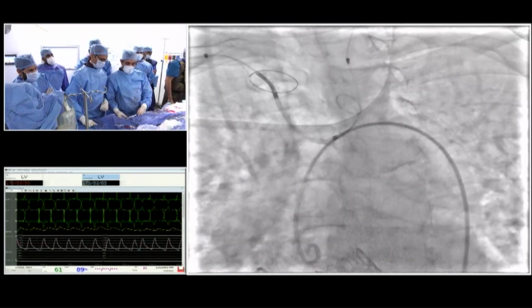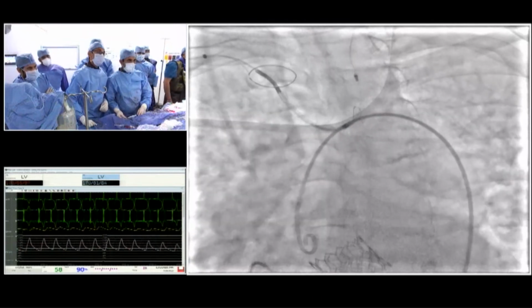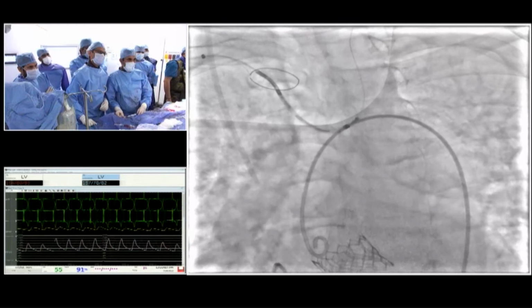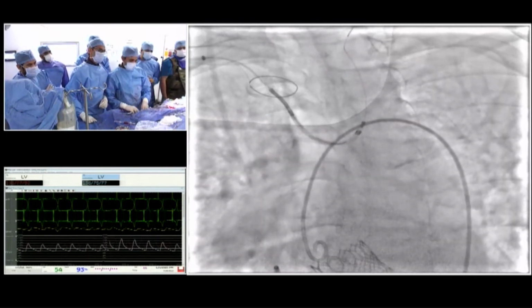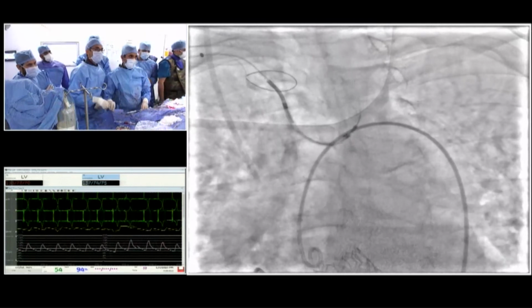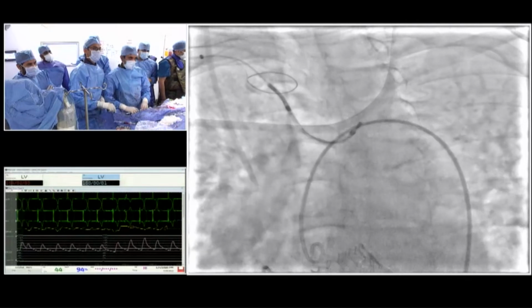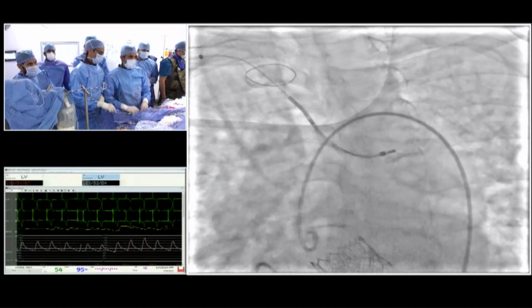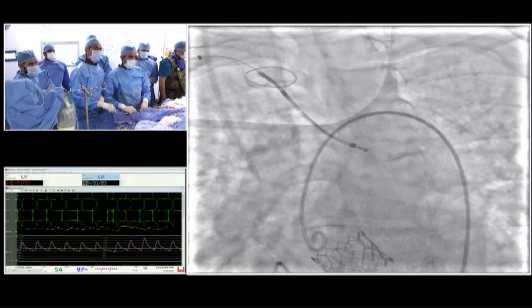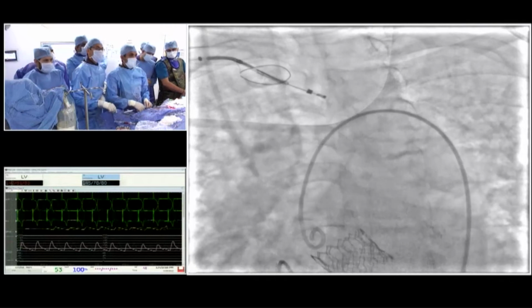So we're going to go ahead and capture the filter. So we're going to capture the distal filter first. You pull back, take it inside the vessel, push down a little, unflex it, pull back the wire, keep it on the soft portion. Okay. I'm going to pull back, lock it, capture the proximal filter.